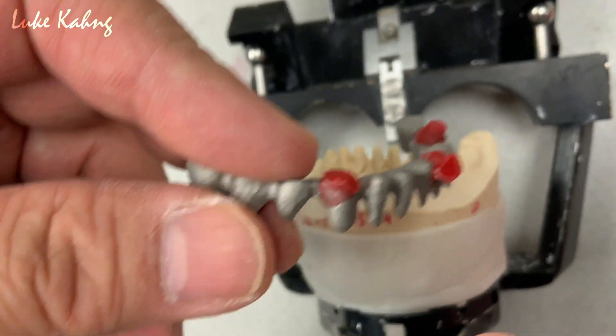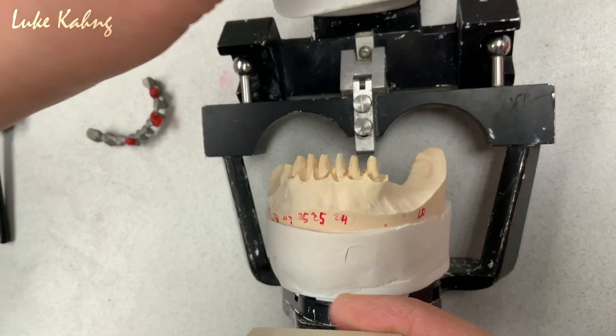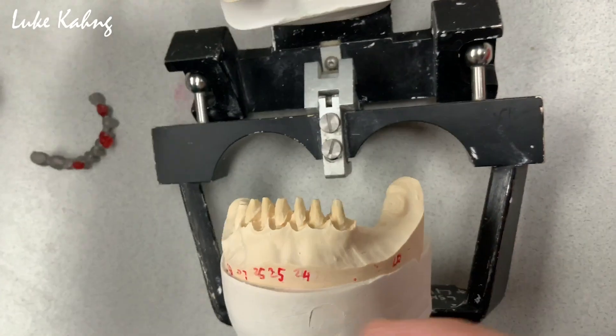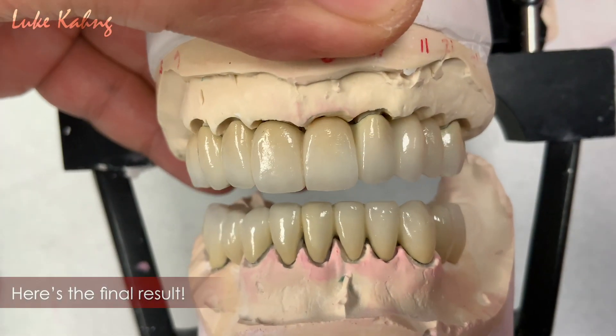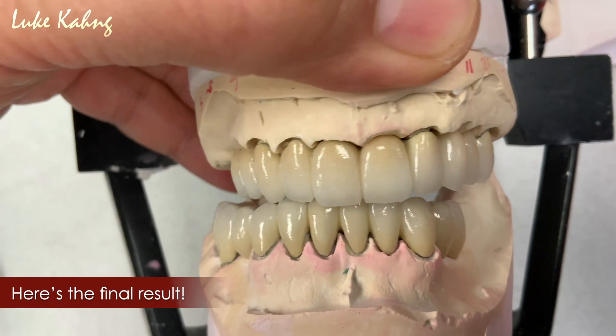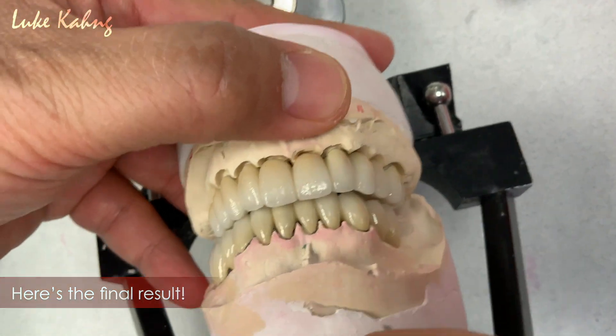I just let Dr. Vincent Foley know, so he has to do those kinds of directions. Anyway, the full mouth case is on the way. Now, another full mouth case — which is splinted together — and we try to get a good centric bite.